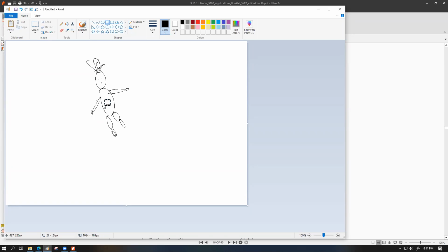You have to think that this is a 3-dimensional thing, although I'm showing you this whole thing on a 2-dimensional figure. So if I try to get a 3-dimensional axis system over here, we're going to scan it from 3 different axes. I cannot physically draw the 3-axis system very efficiently over here, but I can try. Let's say with a different color, maybe it should be better. So let's say this is our y-axis, this is our x-axis, and let's say this is our z-axis. You can name any of them anyhow, but they are all perpendicular to each other.